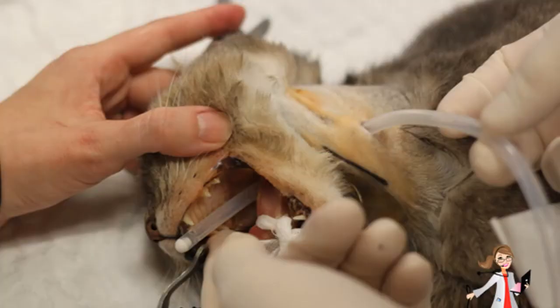This is also shown in this image. The tube has now entered the oral cavity out, and the proximal tip would be here. But doc, it's supposed to be going that way. Why is it going this way?